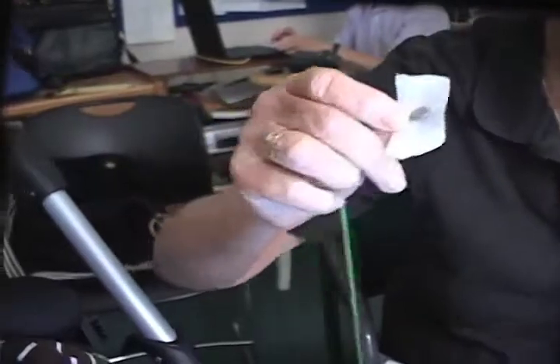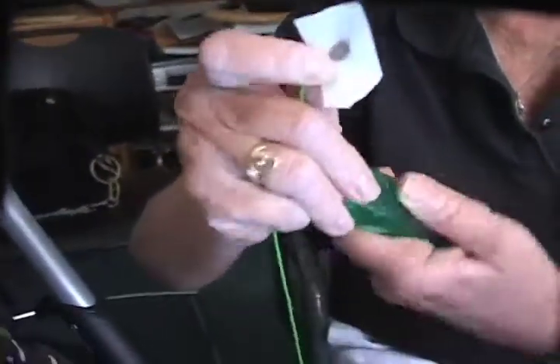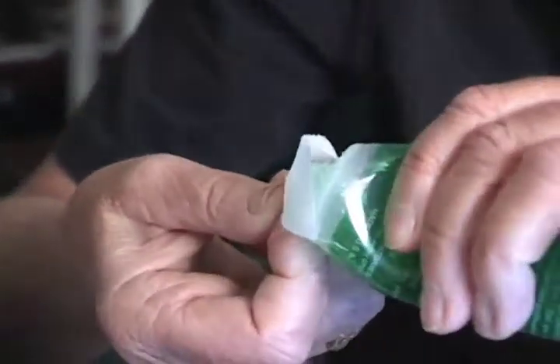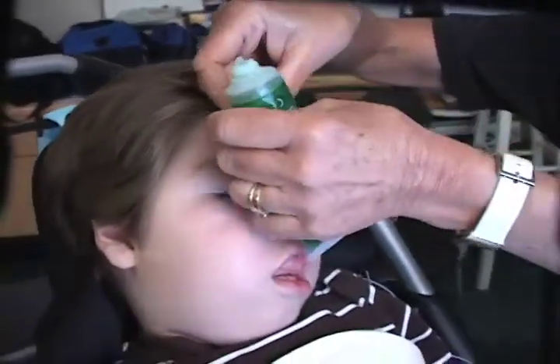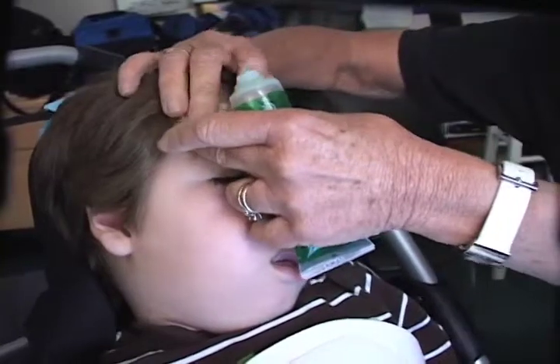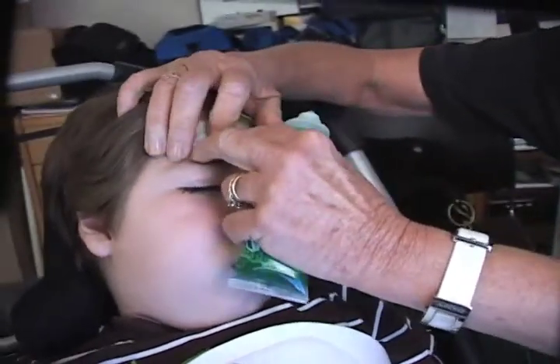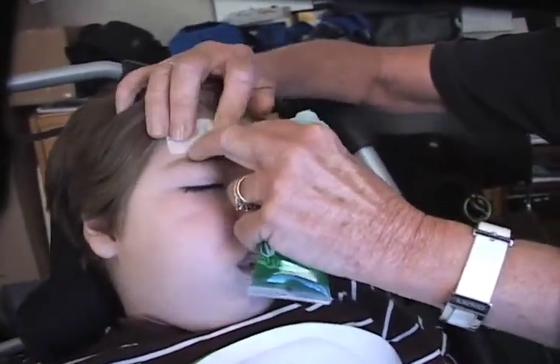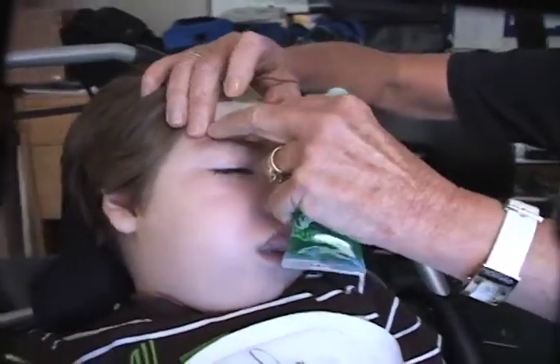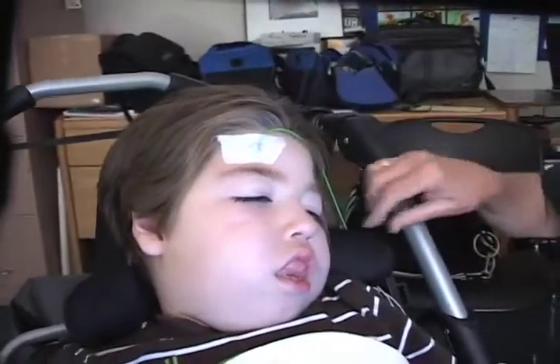I've got the green electrode, and I'm going to put a little bit of the gel that comes with the kit at the end of that. This green electrode is the ground, and I'm putting this above the opposite eye that is going to be controlling the computer. It really doesn't matter which eye controls the computer vertically, because both eyes usually go in unison.